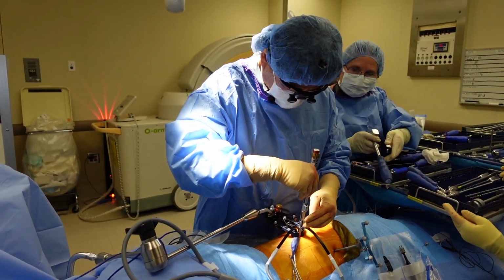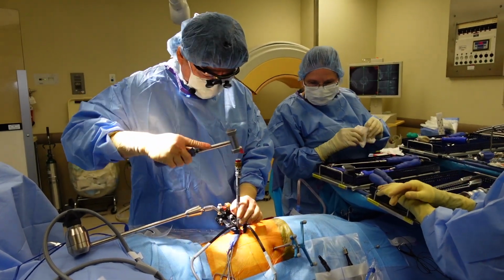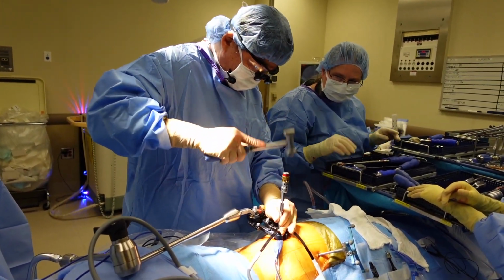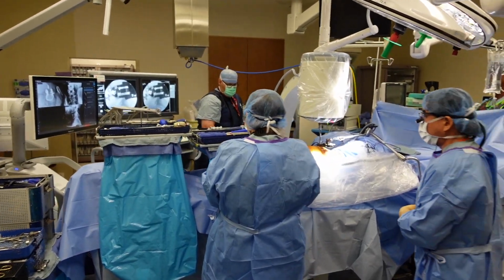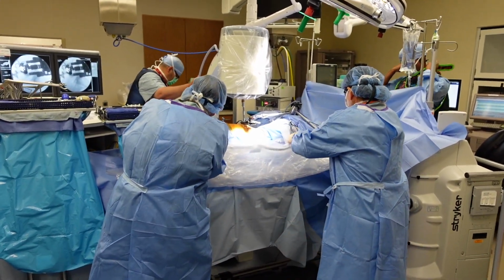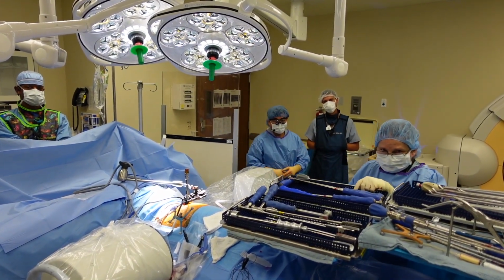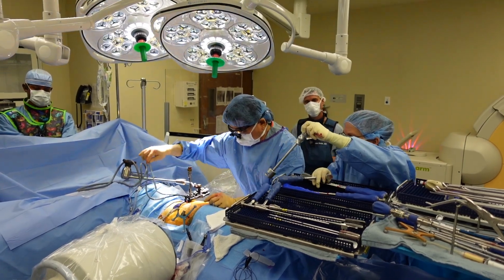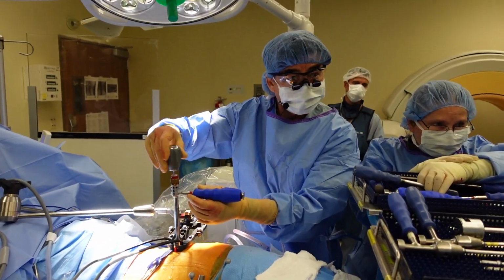Alright, you have the cage. Very expensive, expandable, almost pure titanium. Perfectly shaped to fit in here. Get ready for fluoro. At the anterior vertebral body line, I think. No? Yes. Okay, I have to back this up somehow. Let me have the little side thing. Okay, expanding away like a car jack.